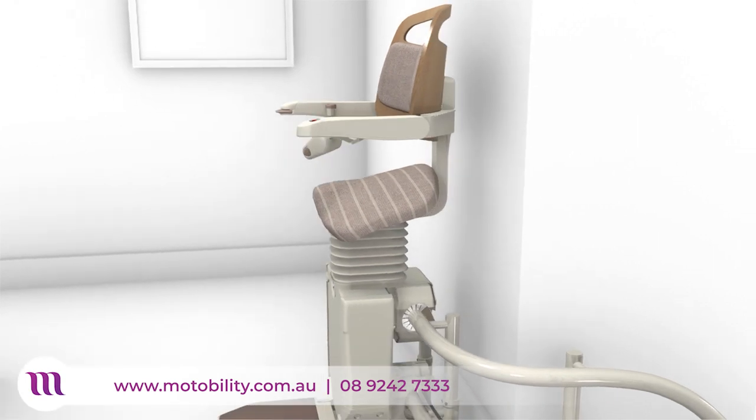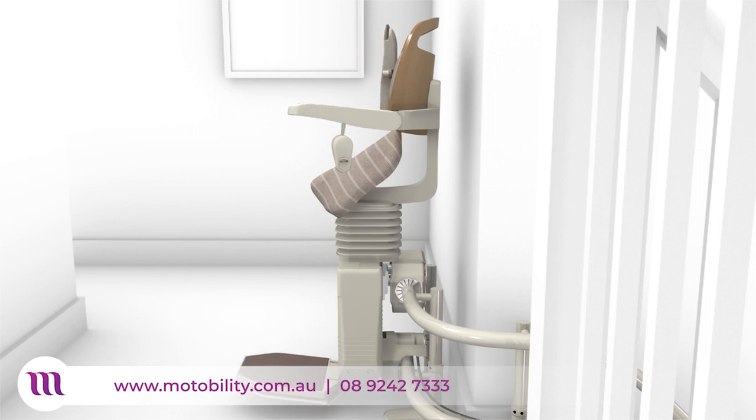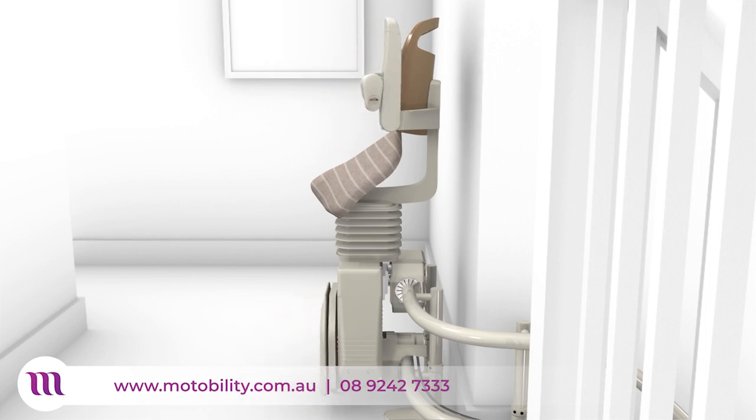Folding the arms will automatically fold the footrest, ensuring users do not have to bend to fold their stairlift at the top or bottom of the stairs, for a compact footprint allowing other people to continue to use the stairs.